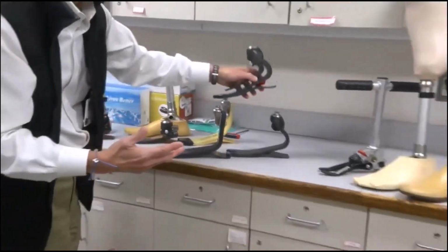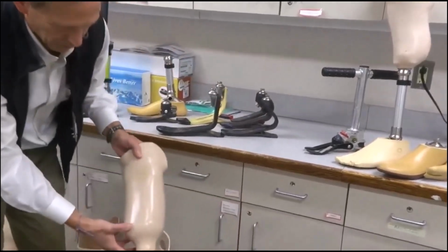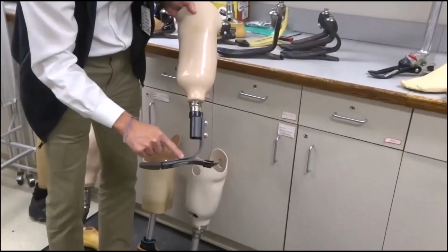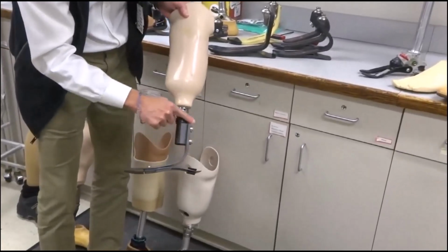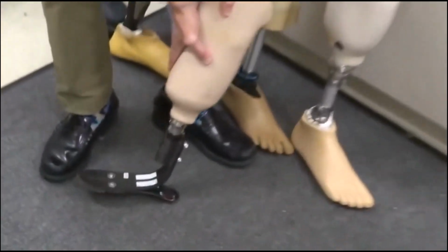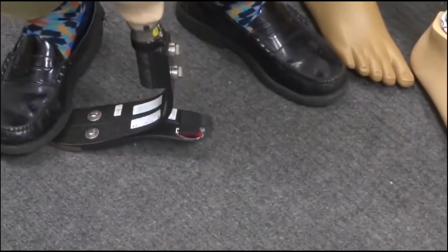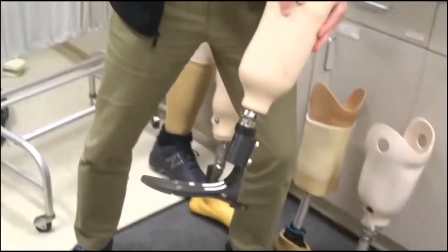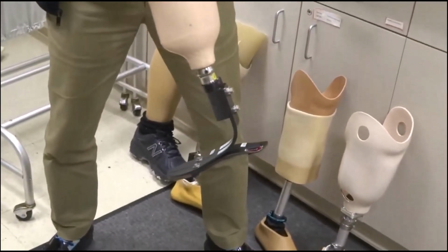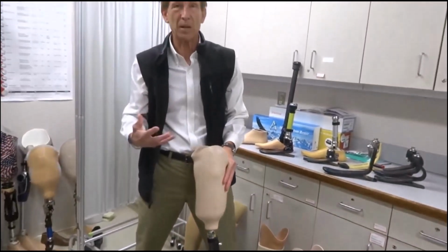So what do I mean by this dynamic response? Let me give you a quick demonstration so you can understand. If we look at this prosthetic foot, you can see it has a carbon fiber strut that comes down across here. The one in the heel is much thinner, so when the foot hits the ground, it bends. And more importantly, it bends when it comes forward, and it gives you a little bit of bounce. So that as you walk, you bend the carbon fiber, and then it springs you forward. That's what dynamic response is.